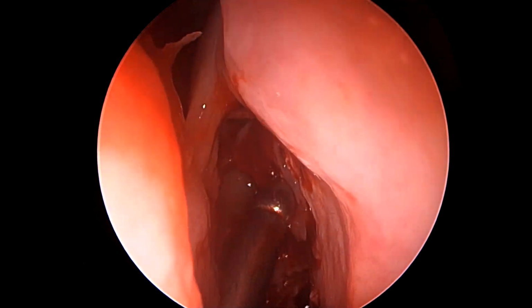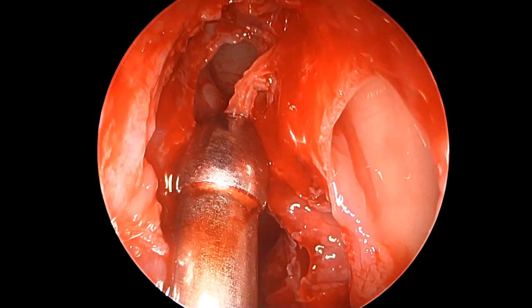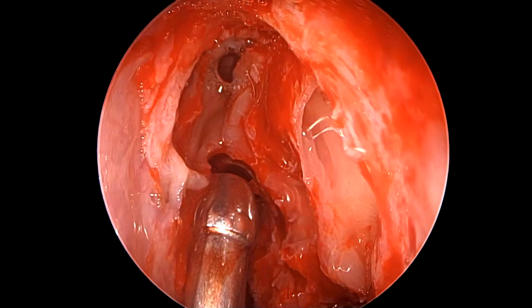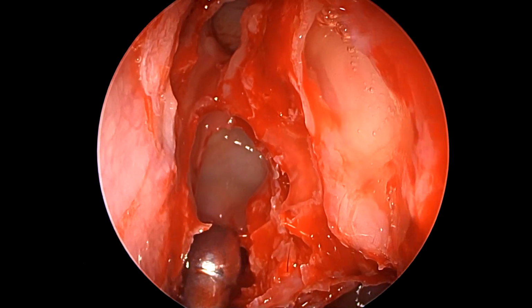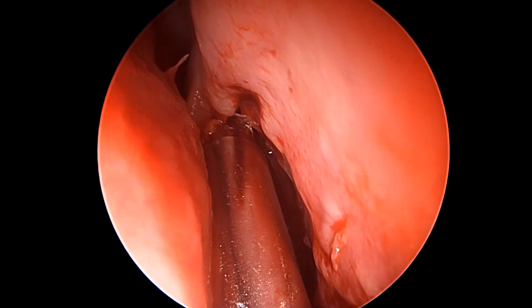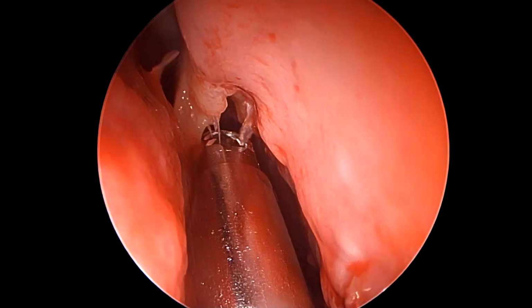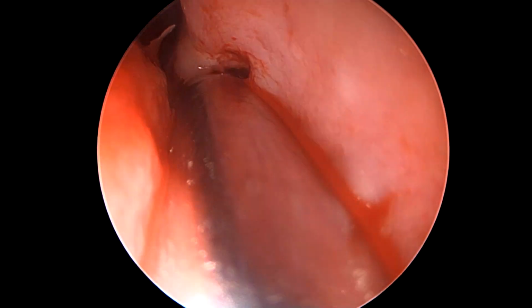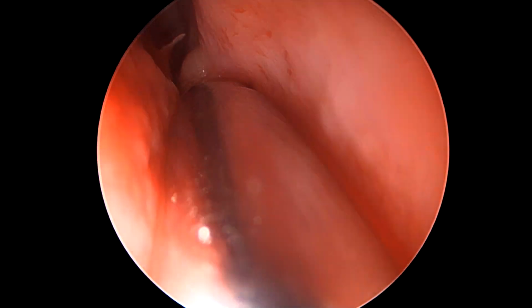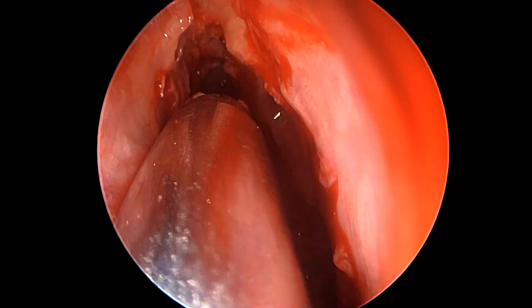Mostly the cells that look like isolated frontal cells inside the frontal sinus are suprabullar cells that become large, and they pneumatize anteriorly along the skull base, along the posterior wall of the frontal sinus. It's very important to remember that these cells' posterior wall is the same as the posterior wall of the frontal sinus. So no attempt must be made to go behind the suprabullar cell, because then you're effectively going behind the skull base and trying to fracture the skull base itself, causing a CSF leak.